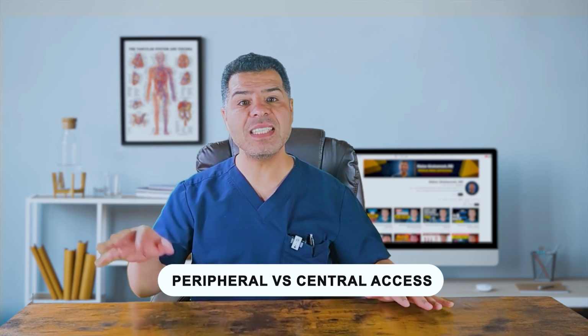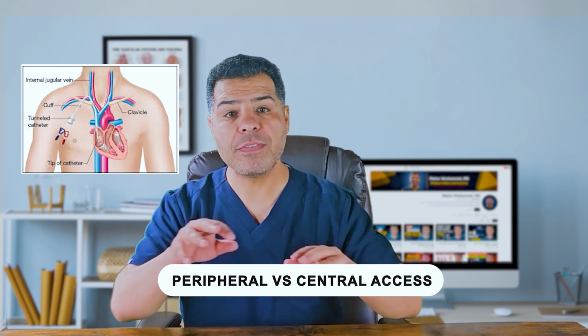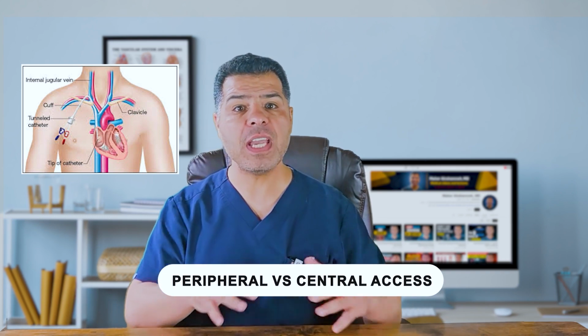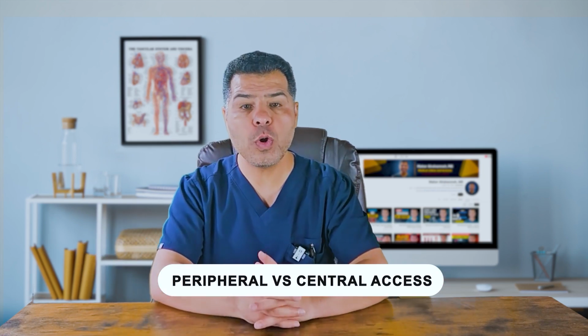Then we have tunneled central catheters such as Hickman catheters or permacaths. These are designed for long-term and frequent access. They run under the skin before entering the vein, which helps reduce infection risk. They are commonly used for dialysis, parenteral nutrition, and ongoing chemotherapy.